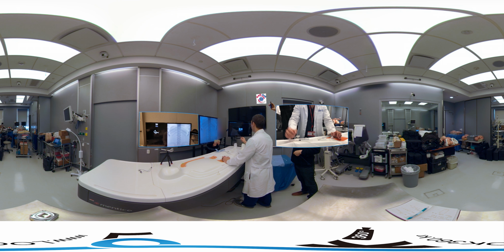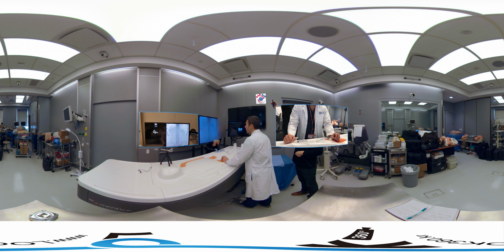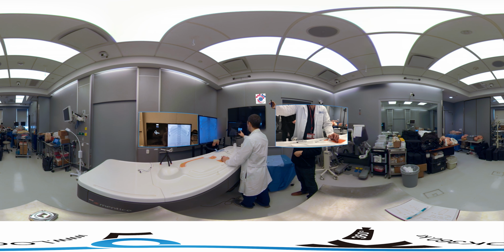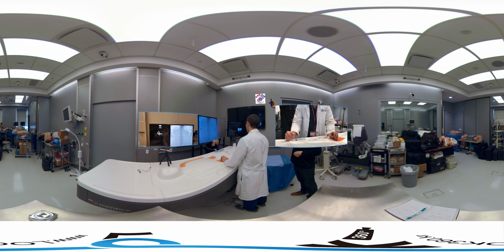And what we'll do now is an actual injection. From this, we can see both the right and the left, no duplicated IVC, and also the level of the renal veins. I'll do it again for you guys. It is approximately at L2, so we're going to want to leave the filter there. And also, you can measure the diameter of the cava to make sure that the filter is appropriate size.